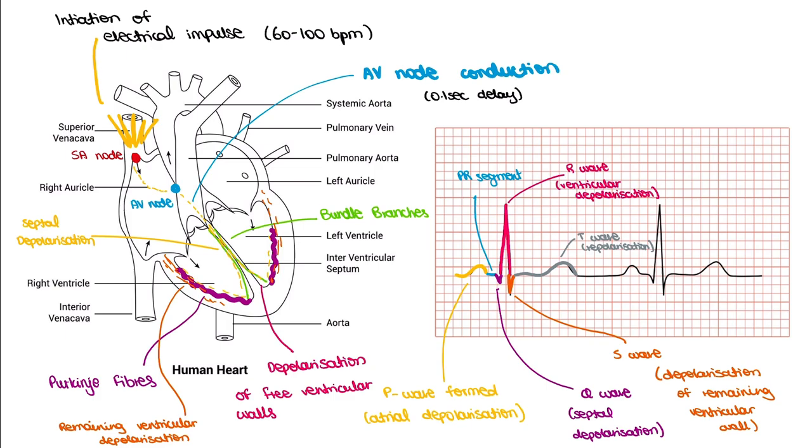And this is a good depiction of what occurs, and this happens every single second. When your heart is beating, it produces this electrical signal for blood to flow throughout.